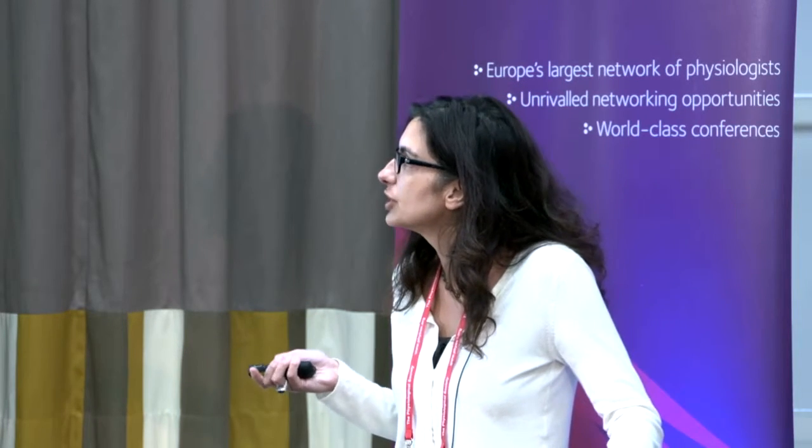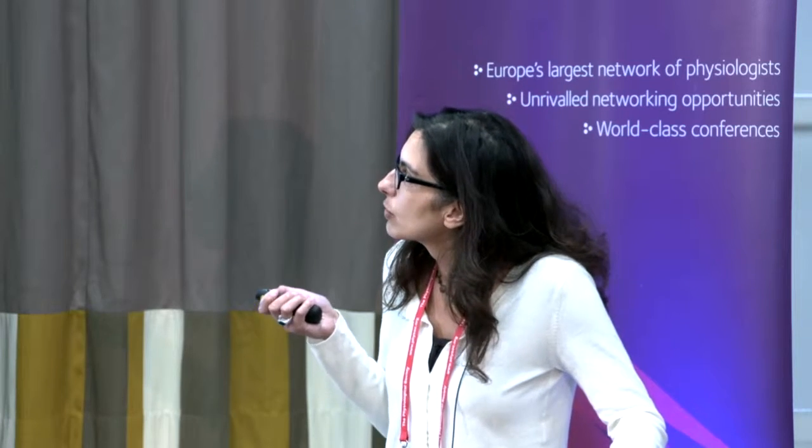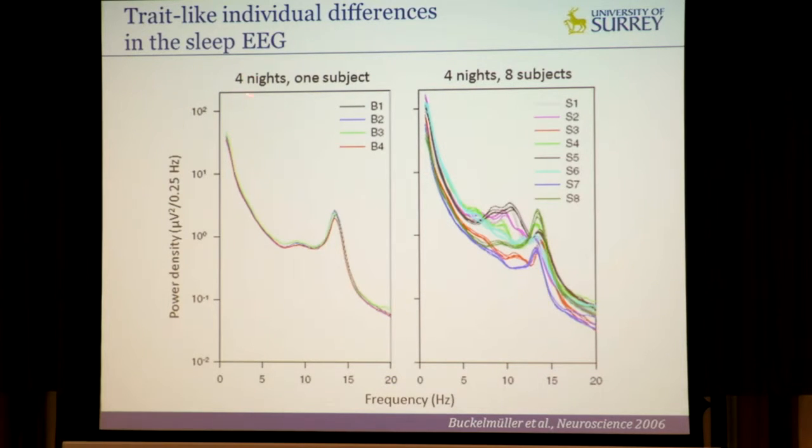So I will spare you the hundreds of studies. There were many inconsistent findings, mixed results, but before we go to that, because I will rebound on what has been said earlier, in terms of trait markers, EEG is actually quite valuable. So this is here a healthy subject. One subject is actually a healthy young university student who was invited into the sleep lab 4 nights at 1 month interval.